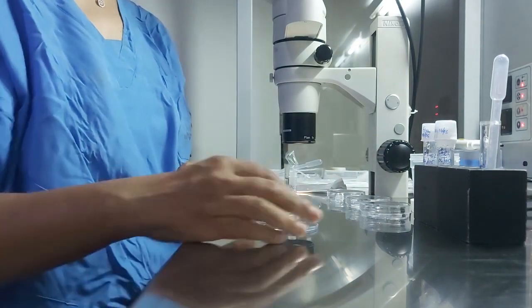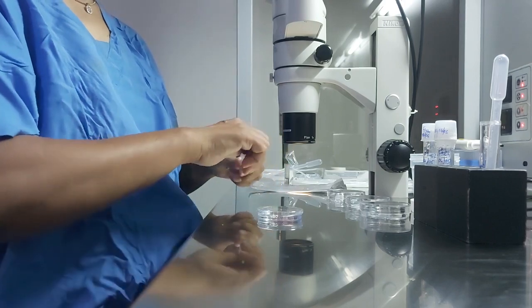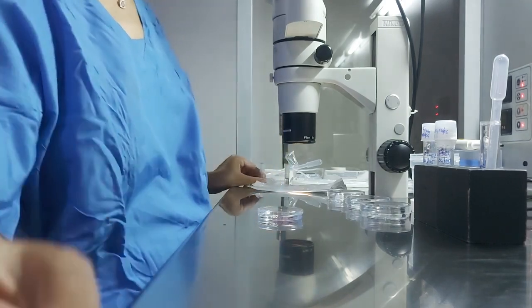So that's it. You have seen how to prepare plates for pickup just before the pickup. Thank you.